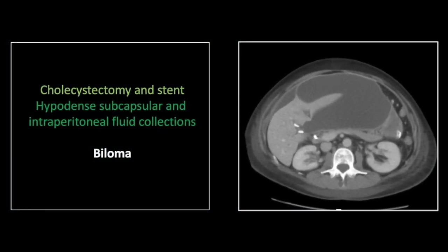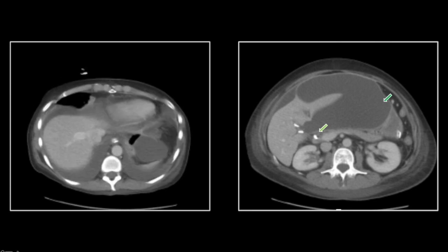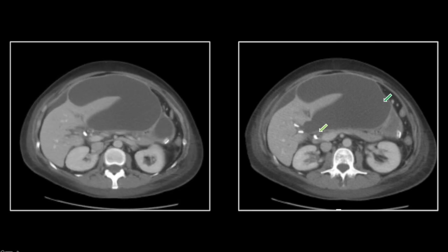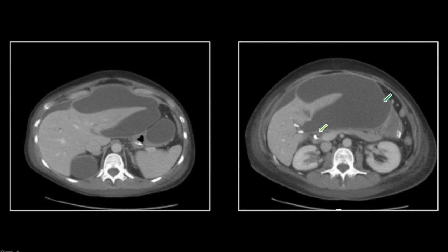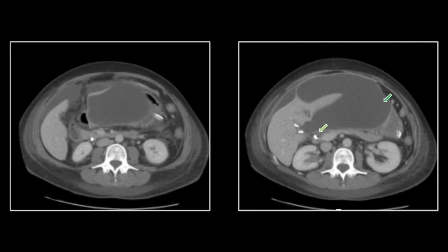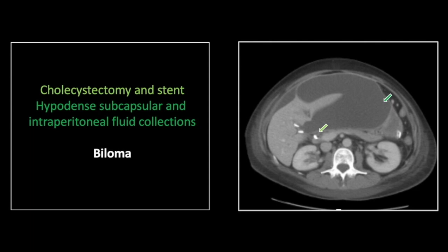Our next case is a biloma — the frequent dreaded complication of cholecystectomy. You can see obviously multiple cholecystectomy clips are present, as well as a common duct stent. In a very typical distribution and location, you can see this large subcapsular hypodense fluid collection outlining the left liver lobe and extending to the portal region, where it ultimately did originate. That is a pretty typical distribution for a post-operative biloma, with its origin there in the portal region in the region of those cholecystectomy clips.